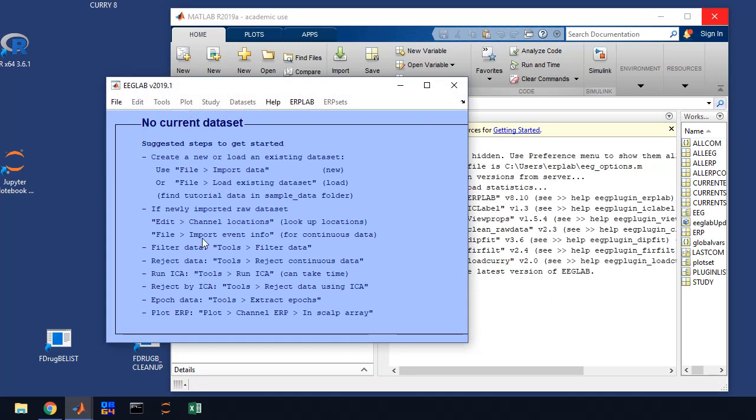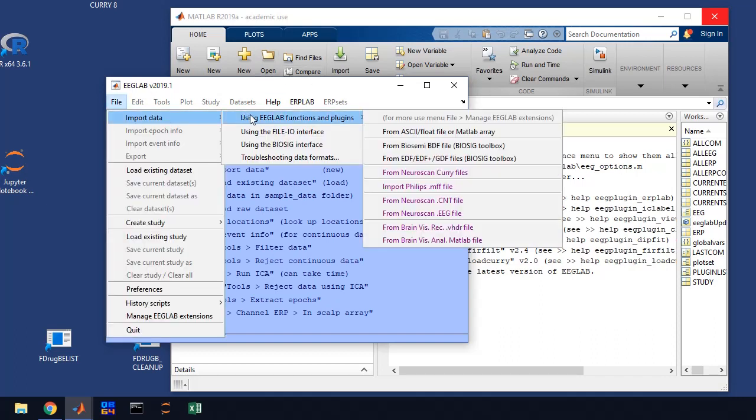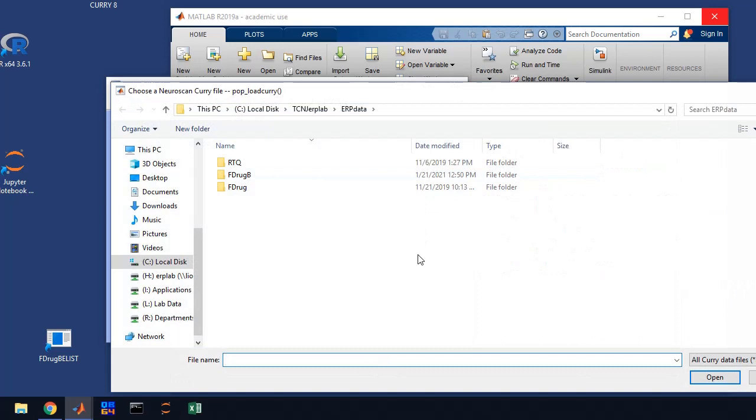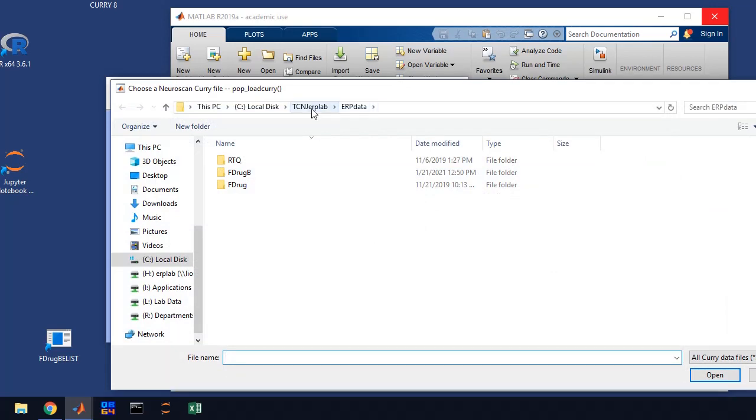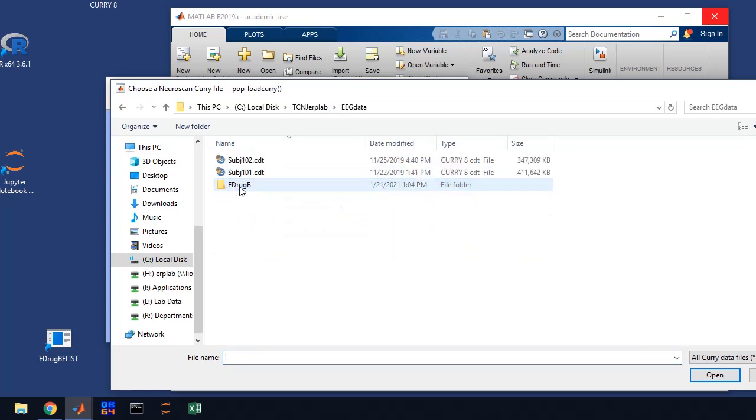The first thing that we're going to do in EEG lab is import our data set. Our data set is recorded in curry, we use Neuroscan amplifiers and we use curry 8 to record the data. We're going to go to file, import data using EEG lab functions and plugins, and we're going to open up a Neuroscan curry file. You'll want to go back one directory to TCNJ ERP lab and go to the EEG data directory.